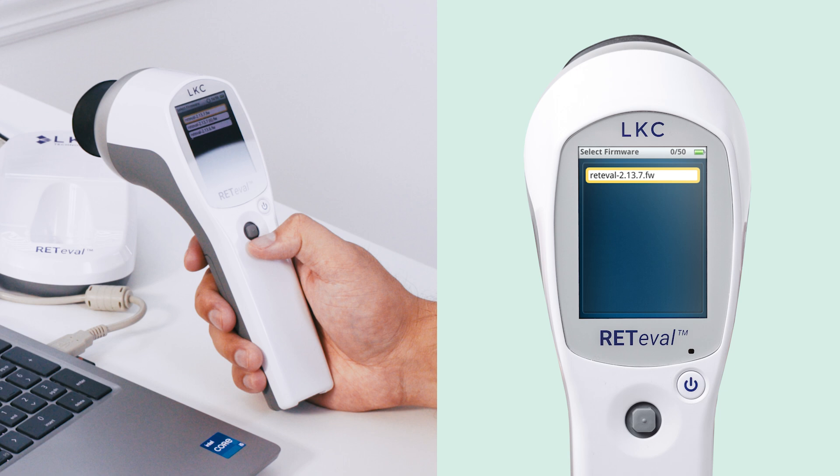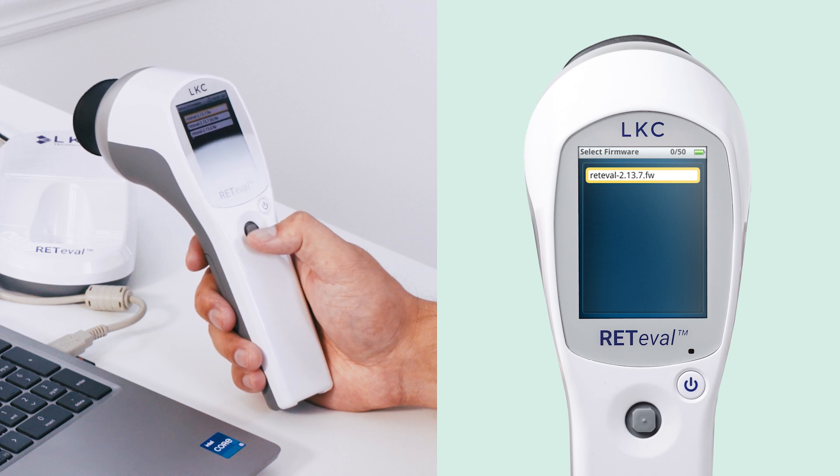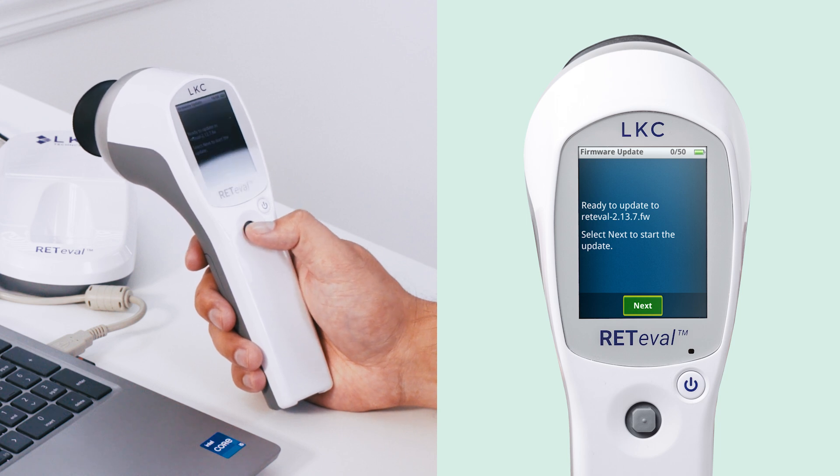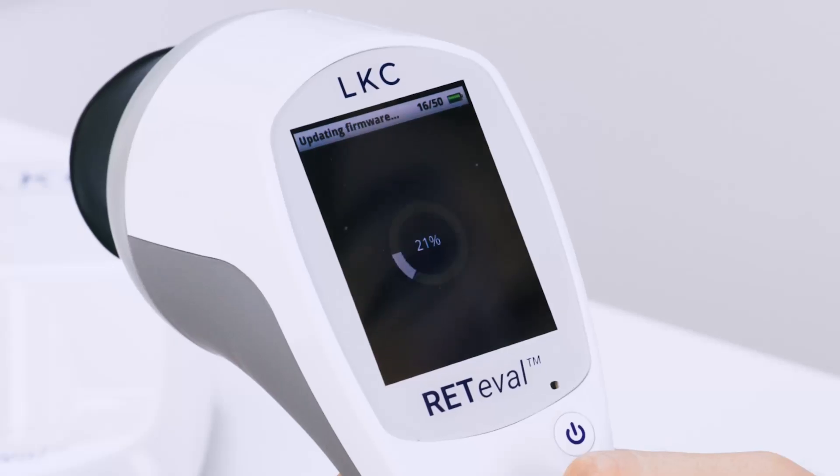The next screen will show prior firmware versions. Make sure you choose the version that matches the file name you downloaded. Once you choose the firmware file, you can select next on the screen.